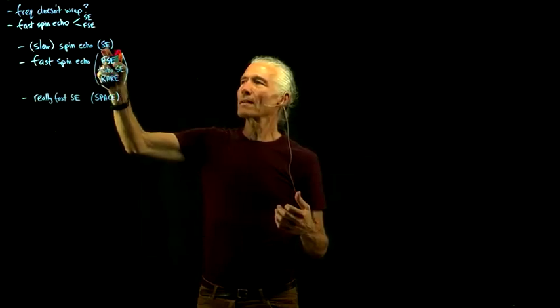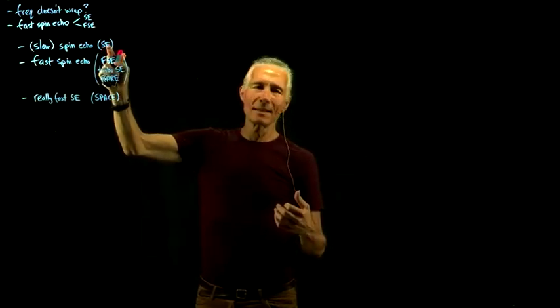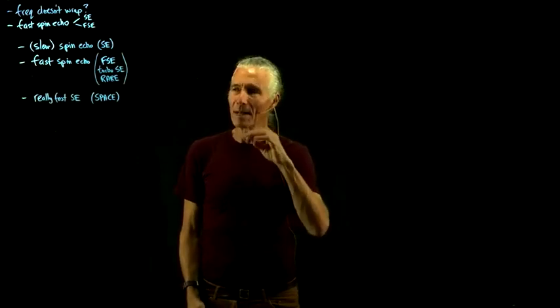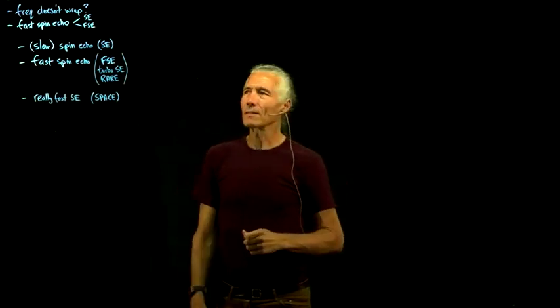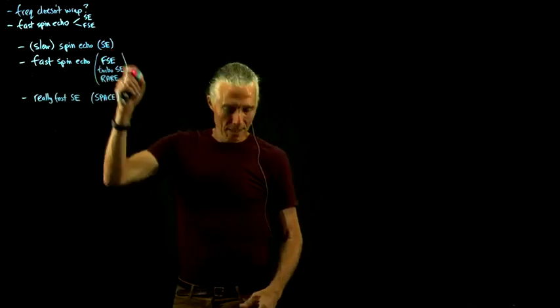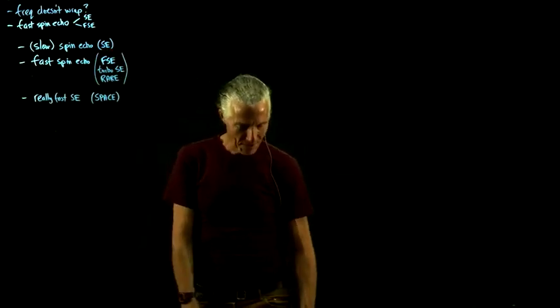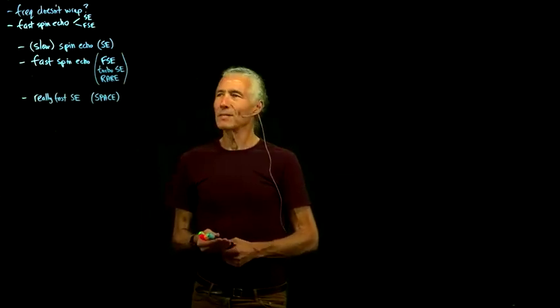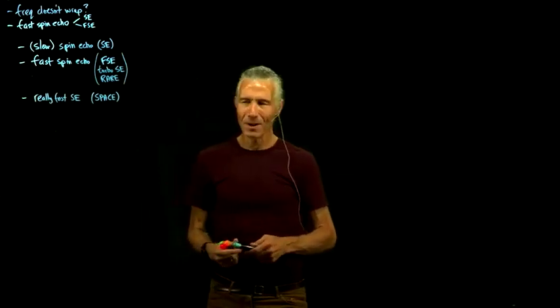A lot of times you might say, well, it takes too long, so I'll just do a couple of slices, if you're looking for some particular contrast. So you might even use this one. It's not completely out of the question. And then we'll look at why it is slow.